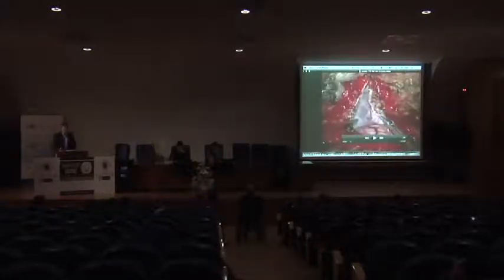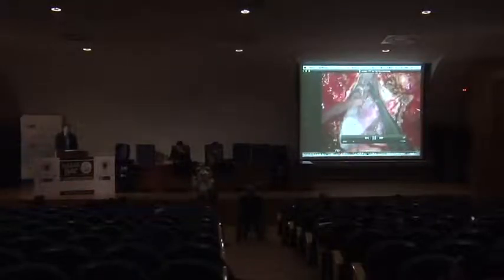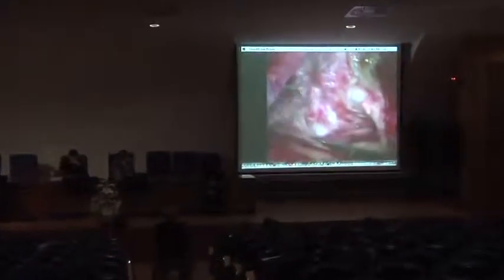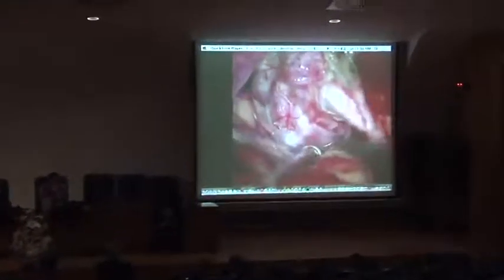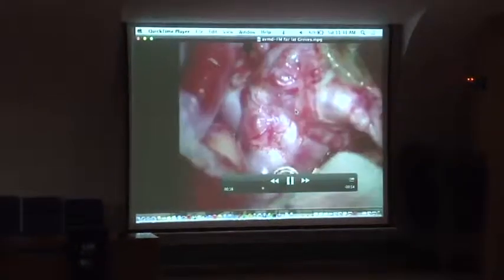So this is a far lateral approach. We are operating on the patient's left side. So you see here our opening, this is the cerebellum there, and we're opening the arachnoid. And it's very intimidating when you're not familiar with this, when you see all these dilated vessels there, what am I dealing with? You got to remember that you just need to find the foot of the vein.